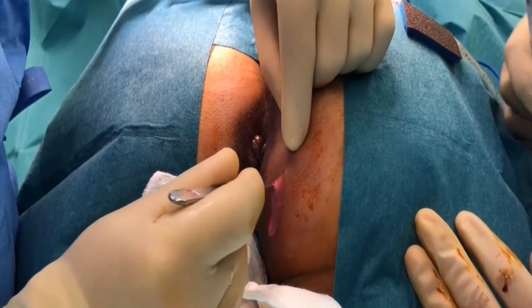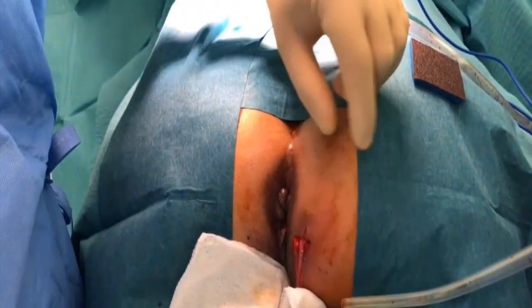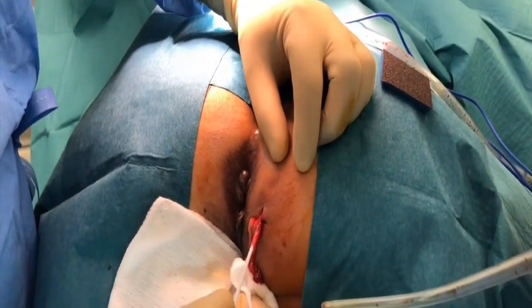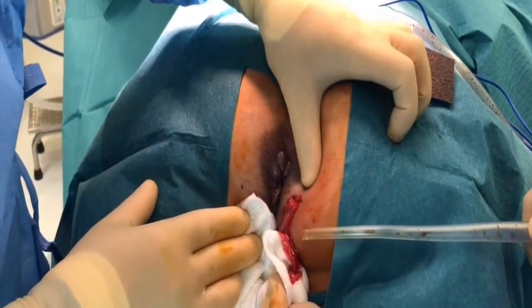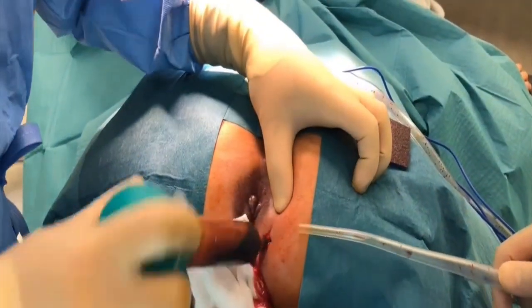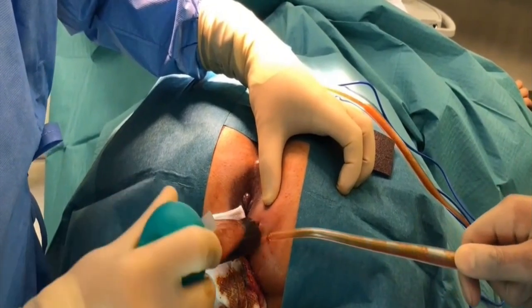A 1.5 cm cruciate incision is performed. Drain and culture the pus as it flows out of the cavity. Milk the pus out. Irrigate the cavity with betadine.